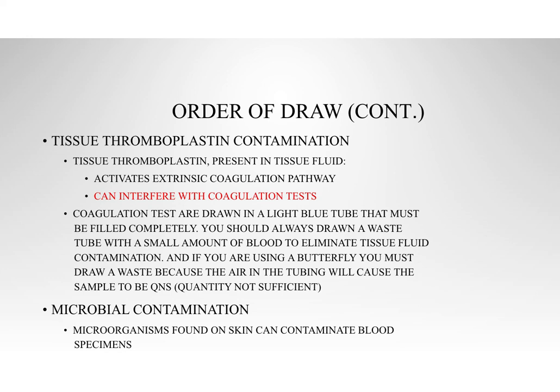All right, tissue thromboplastin contamination can interfere with coagulation tests. All right, that is talking about tissue fluid. When we do capillary sticks, we always have to wipe away the first drop so that we are not getting any contamination from the tissue fluid, okay?